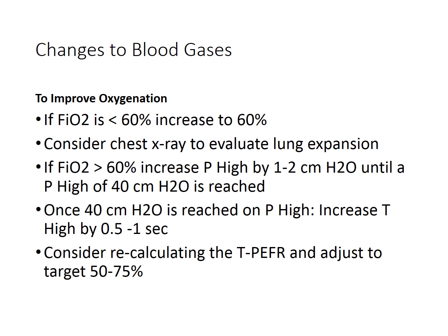Consider getting a chest x-ray to evaluate lung expansion. It's very important, especially with initiation within the first 2 hours, or right around the 2-hour mark, getting an x-ray to see how well you are expanding the lungs. The P high that you set may not be enough pressure to open up the lungs as much as you need.